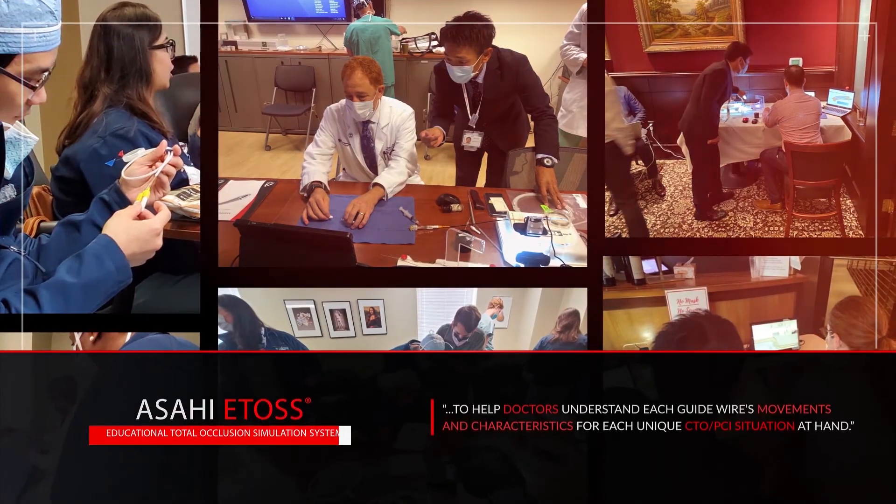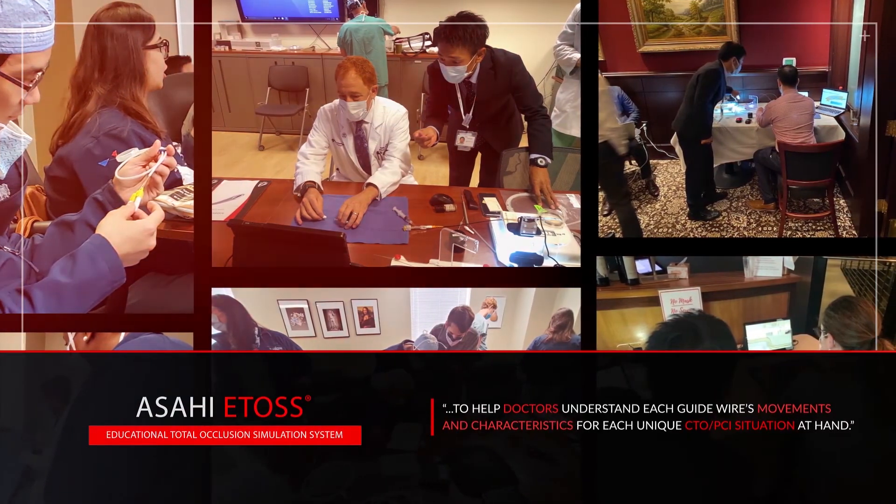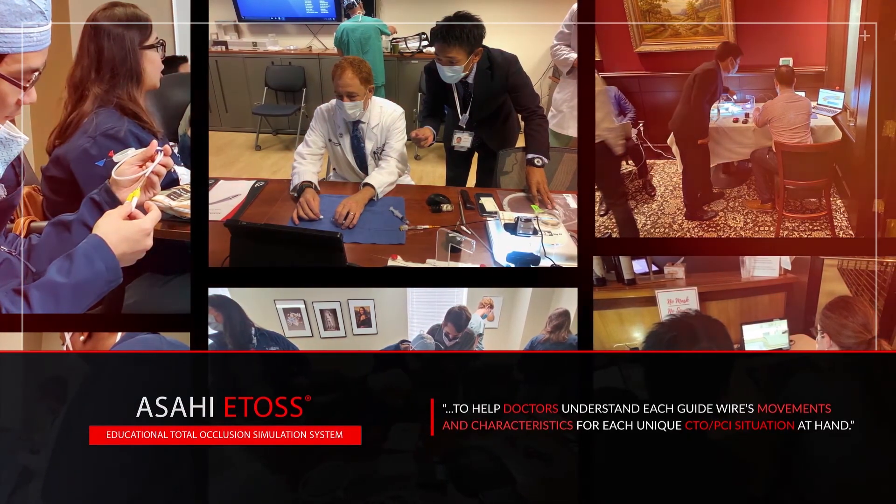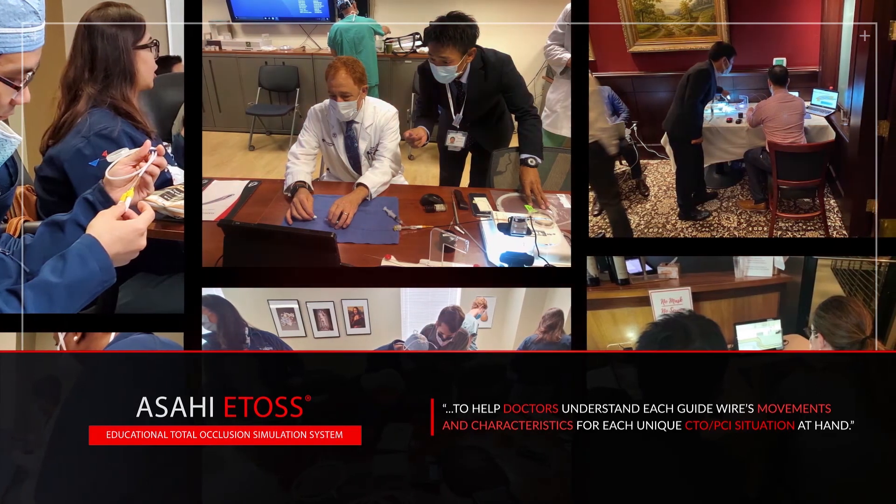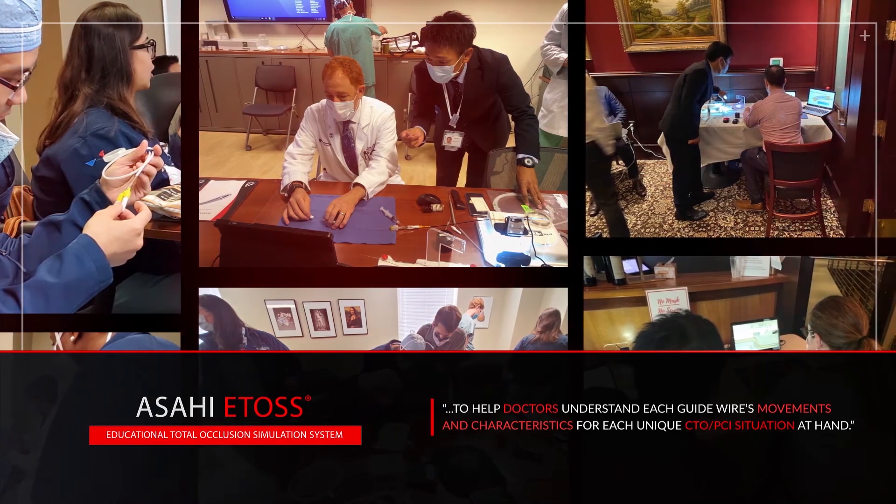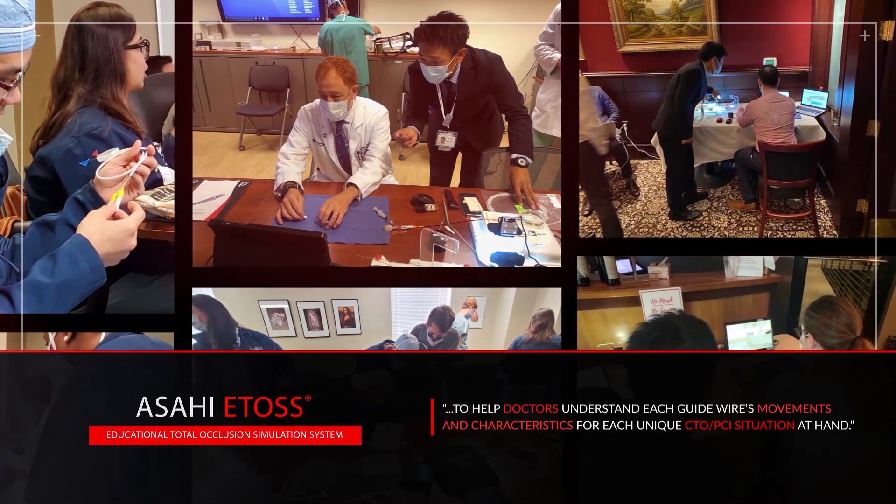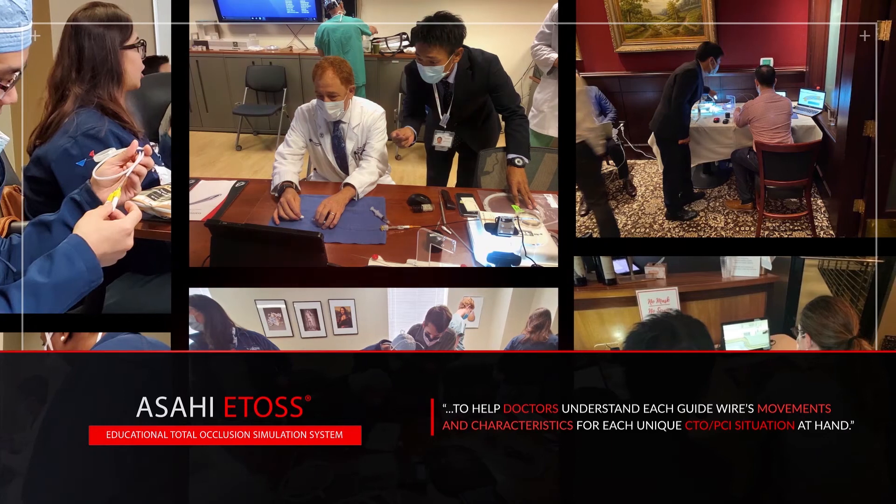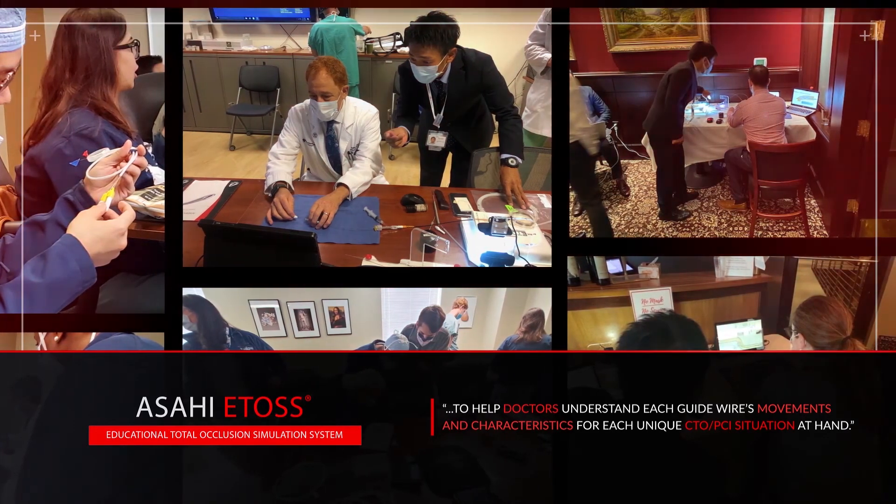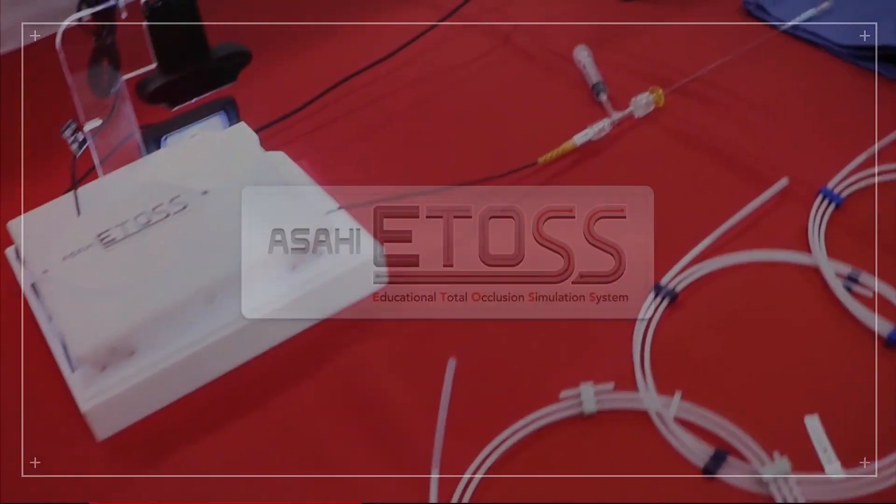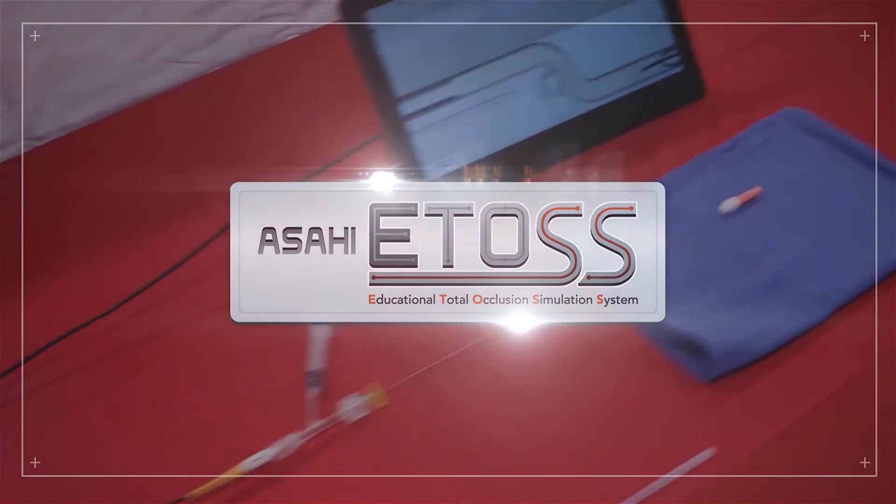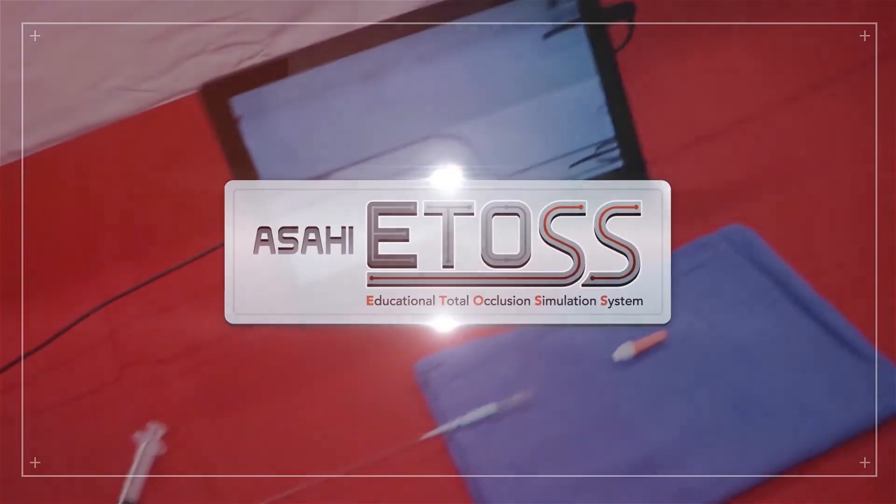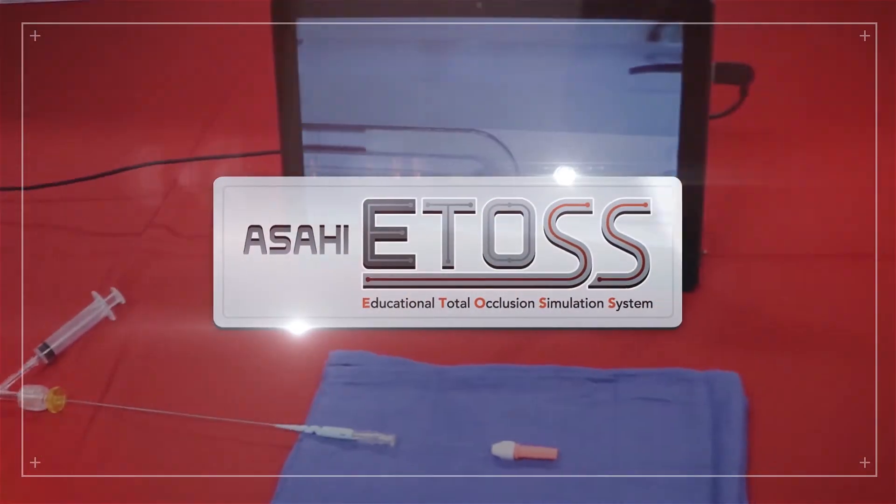Currently, eTOS has become Asahi Intech's gold standard to help doctors understand each guidewire's movements and characteristics for each unique CTO PCI situation at hand, making their job and their patient's experience as safe, comfortable, and time-effective as possible.